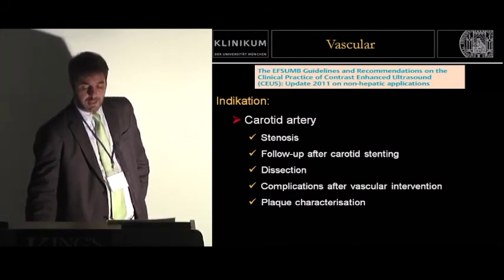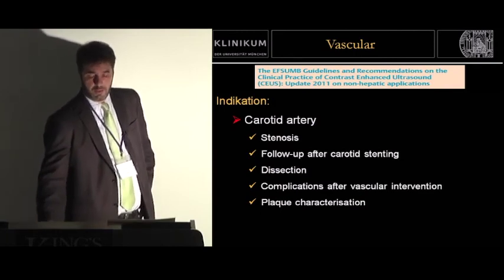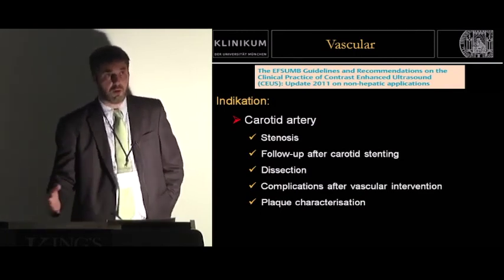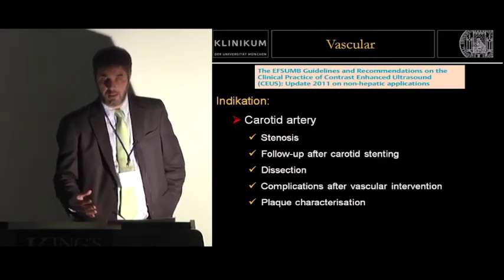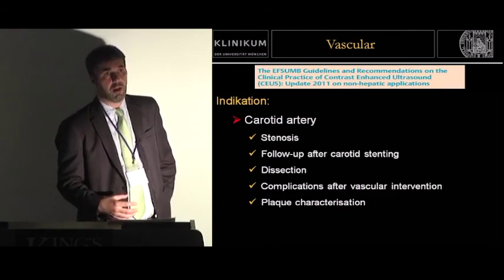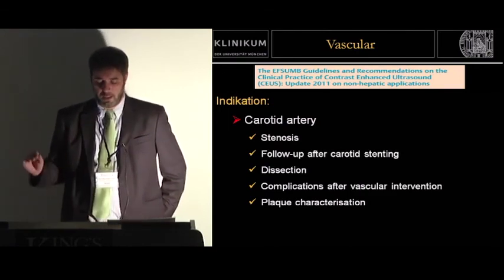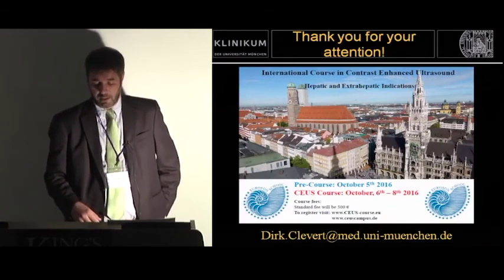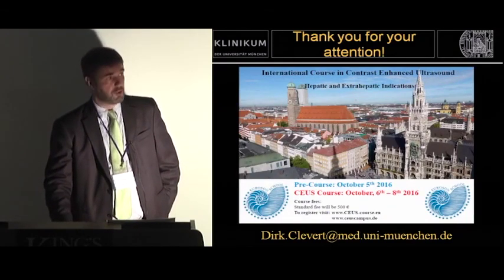So you have seen there are a couple of indications for the vascular guidance. The recommendation was carotid artery stenosis or follow-up after carotid stenting. There also seems to be some advantage regarding dissection or complications after vascular intervention. I don't speak so much about carotid plaques because otherwise I would need another half hour in this session.